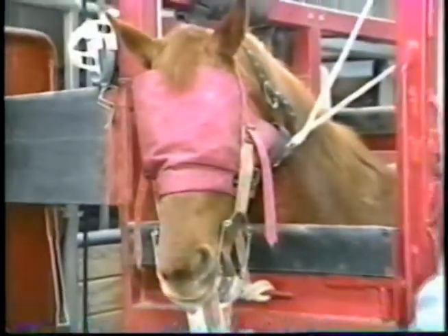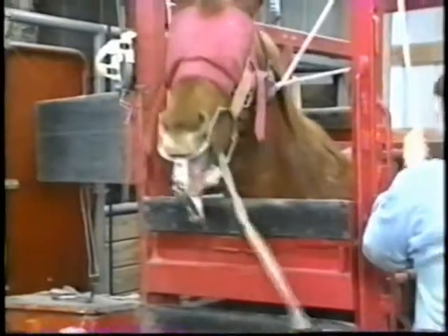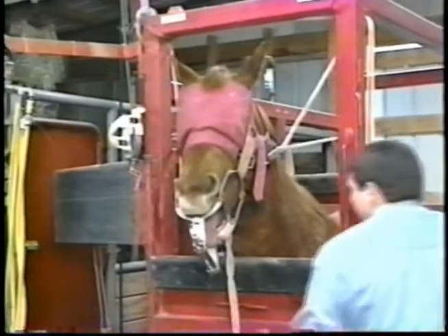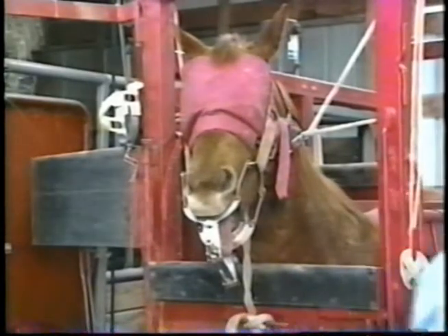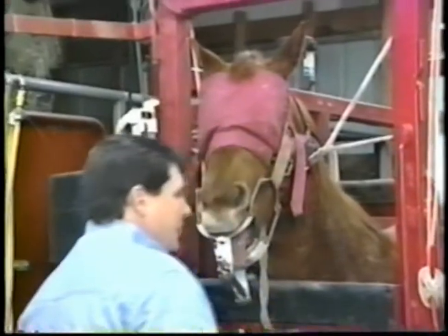Once the mouth is thoroughly washed, an arcade speculum is used so that both owner and veterinarian can view the extent of the lesions present.